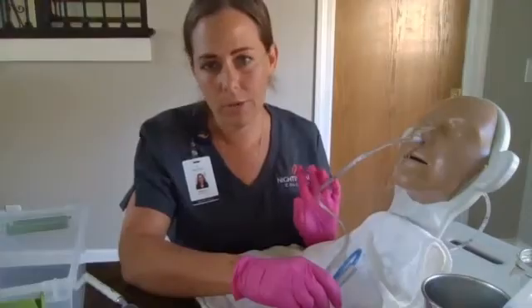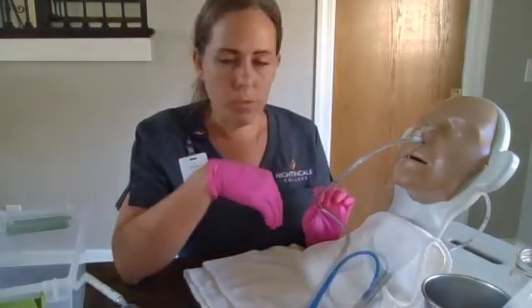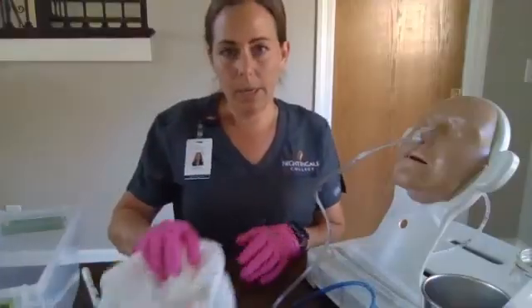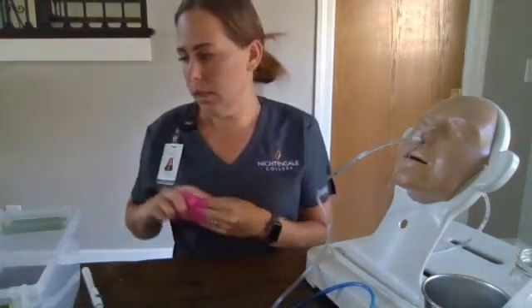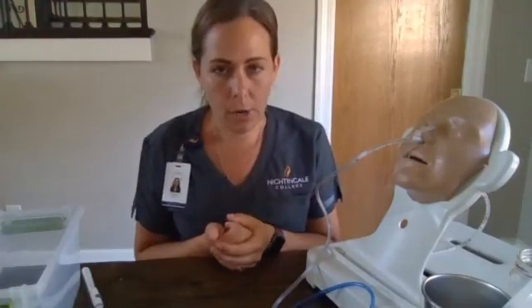We'll continue to assess and document the contents of the suction canister, including the amount and the characteristics. Once we're done, we will discard our supplies, put him in a low and locked position in a position of comfort. We're going to discard our gloves, perform our hand hygiene, and document our procedure, including the care we provided, the assessment findings, and the patient's response.